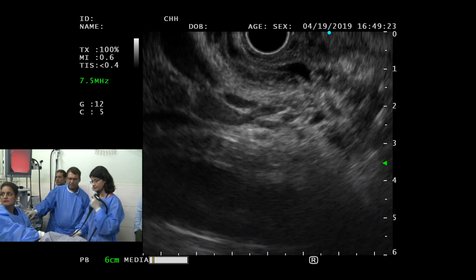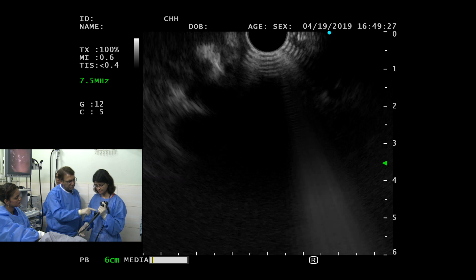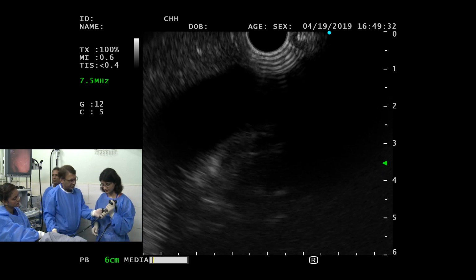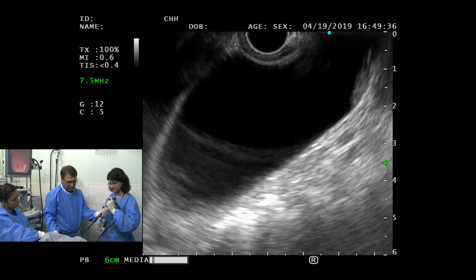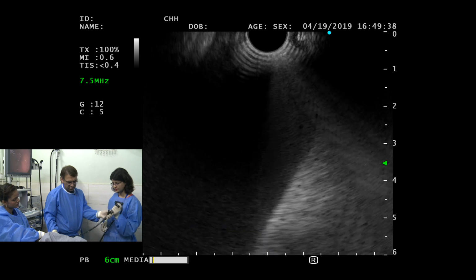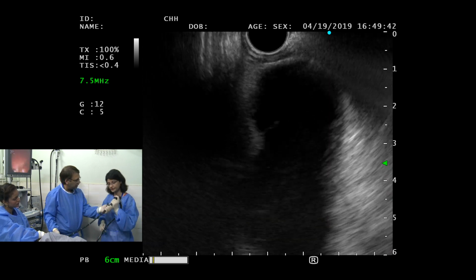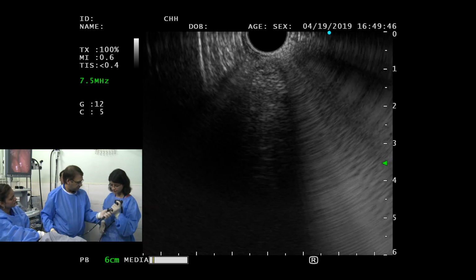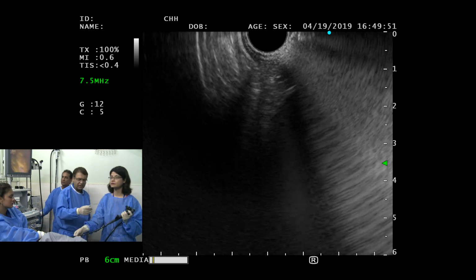और फिर तरीका क्या है? ये तो मैं move कर रहा था. आपका हाथ बहुत ज़्यादा मूव कर रहा है. स्कोप के नंबर मूव नहीं कर रहे हैं. थोड़ा पीछे हो गए, ठीक है. It should move like this. So I should move it from here. आपकी पूरी मूवमेंट जो है ना वो नहीं ट्रांसमिट हो रही, और उसकी वजह ये थी. एक मिनट ज़रा दिखाएं, मैं देखूं और कुछ नज़र आएगा इसमें या नहीं.